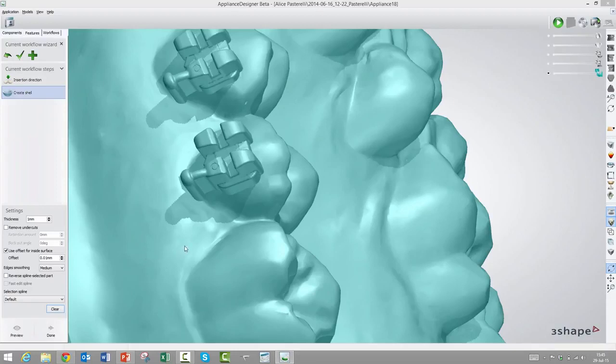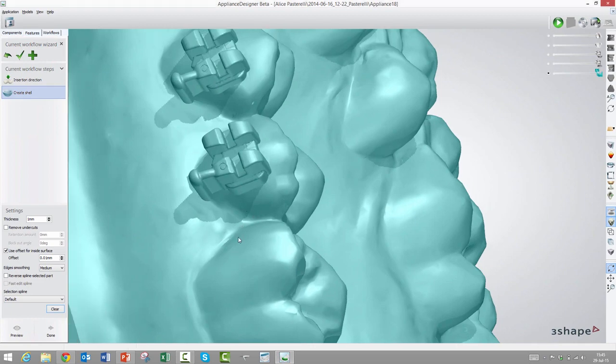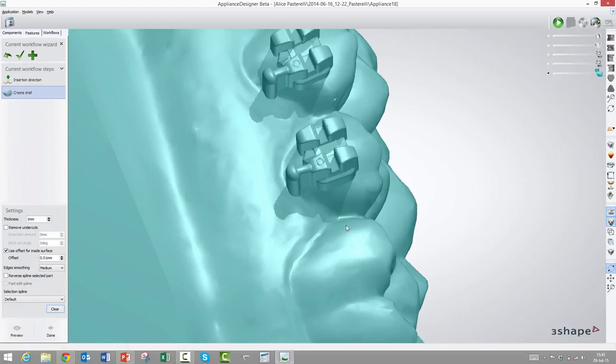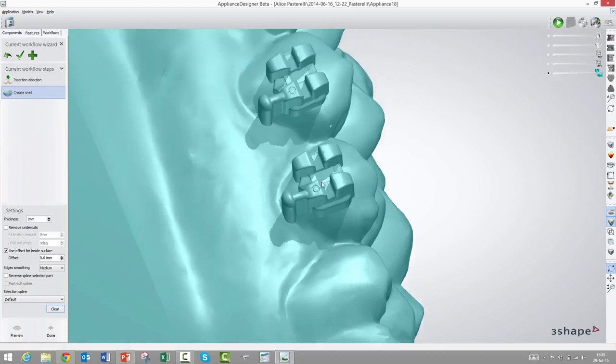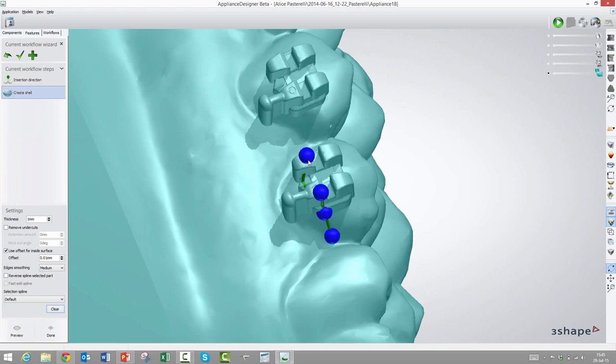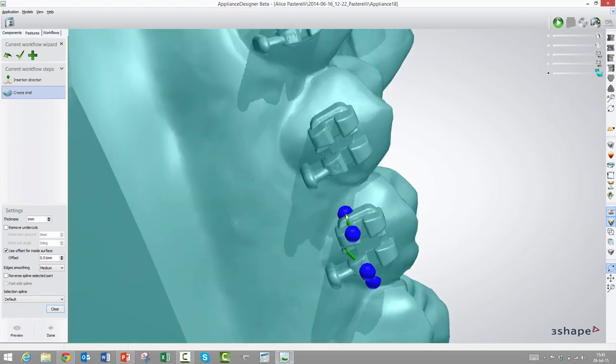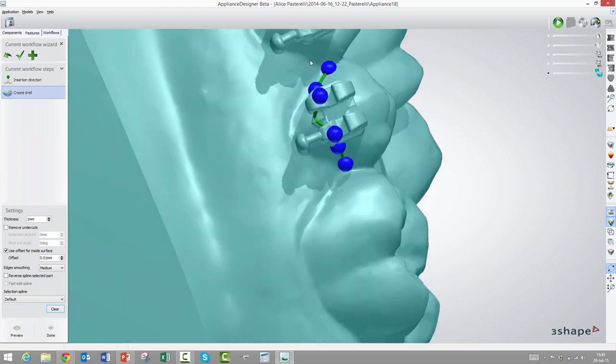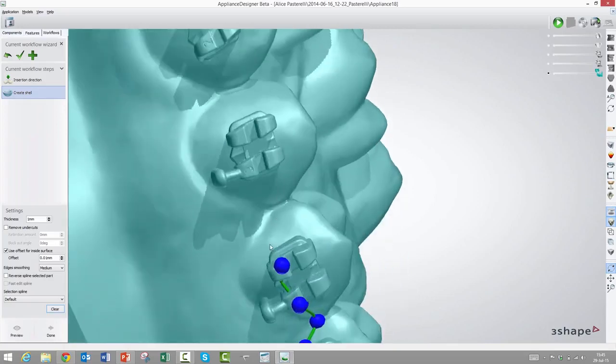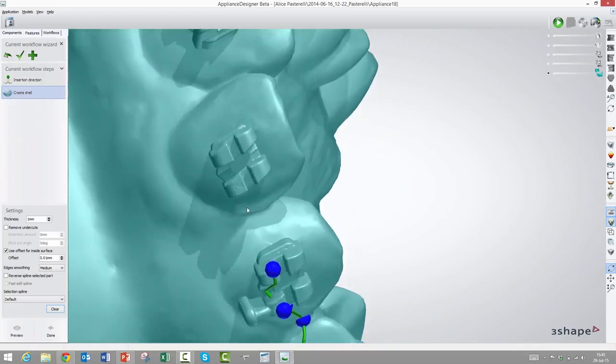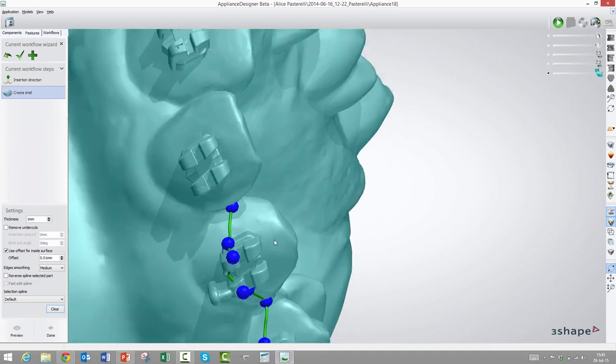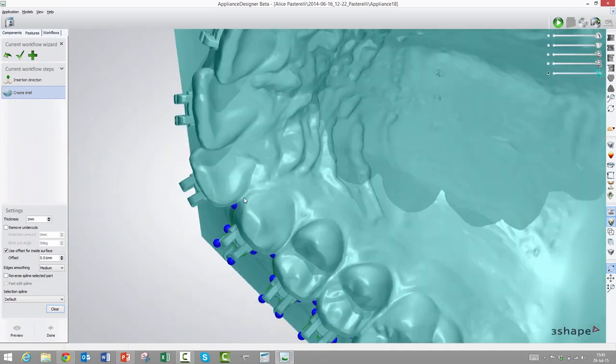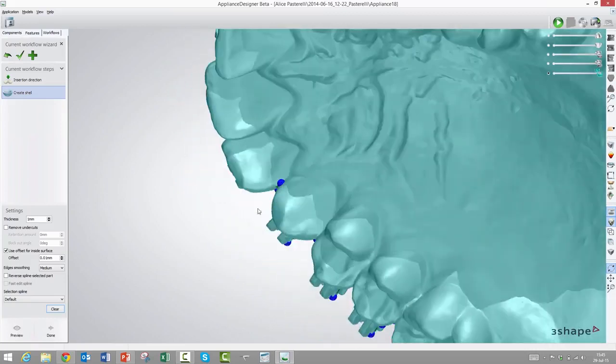So with the insert direction properly set, now we need to trace where we want the transfer tray to go. And we would like the transfer tray to grip around as much as possible of the brackets, but at the same time allow it to escape once we remove the transfer tray from the patient because it obviously needs to come off. So if we have an open space here towards the gingiva edge of the transfer tray, then the bracket will be able to escape once we pull out the transfer tray in the direction of the insert direction here. So I suggest we try tracing along the bracket edge here. That would be the lower edge of the transfer tray. I won't do the entire, just two, three, or four. You'll get the idea.